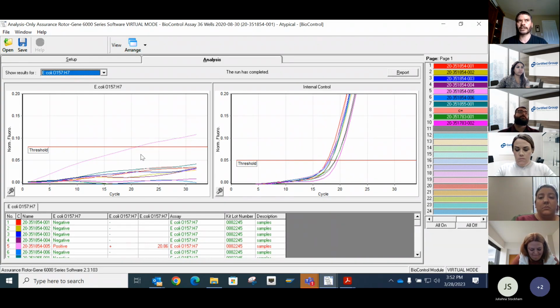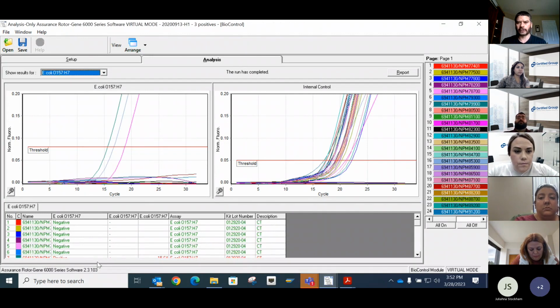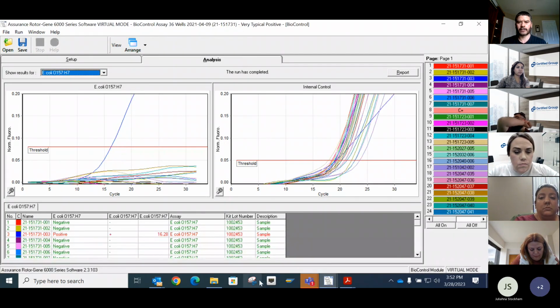But this is what you're going to see when the results are not valid positives. I would say almost exclusively, outside of a couple others, and usually the others revolve around broken instruments, or all the contents evaporating out of the amplification tube. But this is your number one thing, and if we go back, it looks nothing like our valid positives.